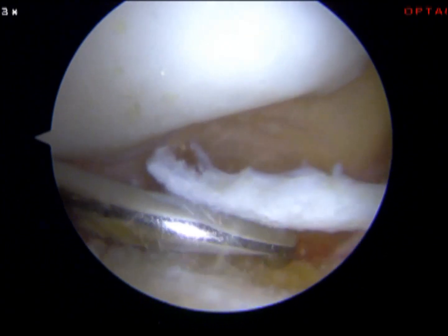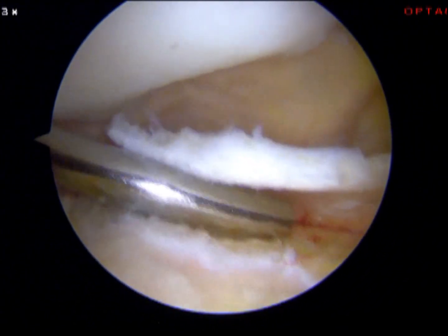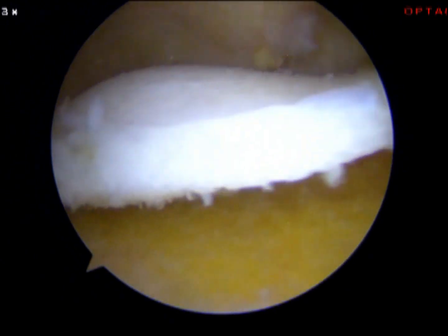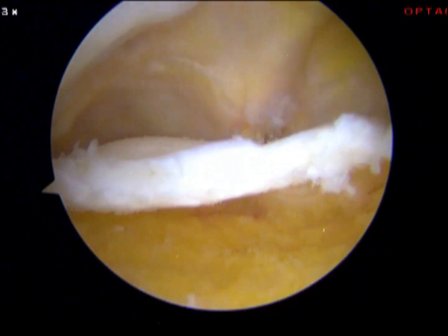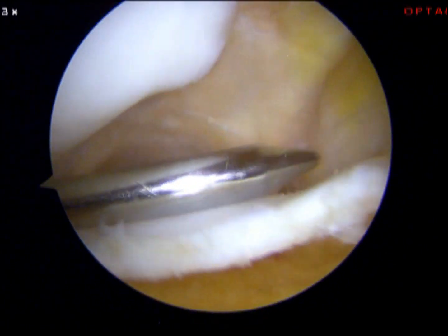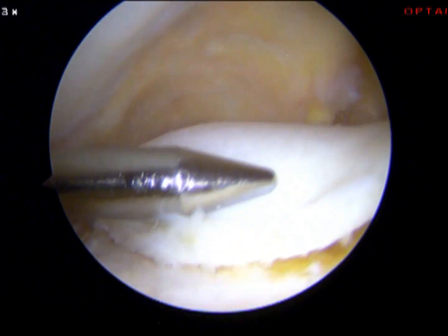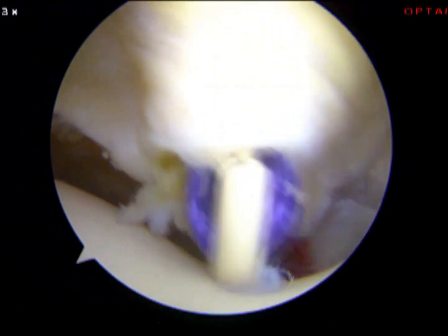Having reached that area, I'm going to make a deeper and more lateralized groove — meaning that the groove has to be more to the outer side. Here I make the trochlear deeper. And having made the trochlear deeper, I need to test out if the cartilage flake is plastic enough to reach the new groove. I use this device to press the cartilage flake into the new trochlear groove, and you see it fits nicely.